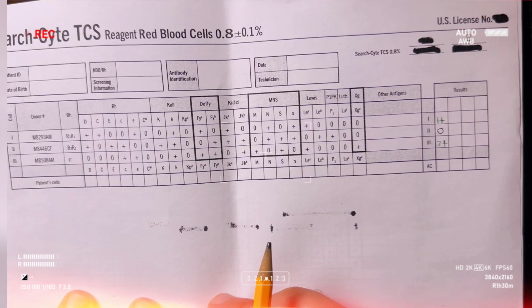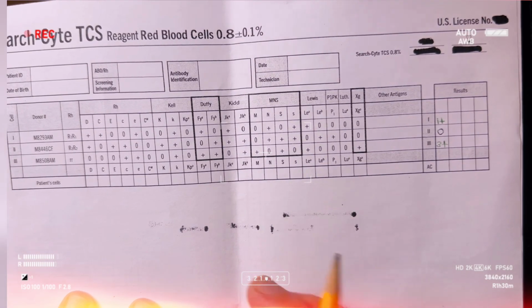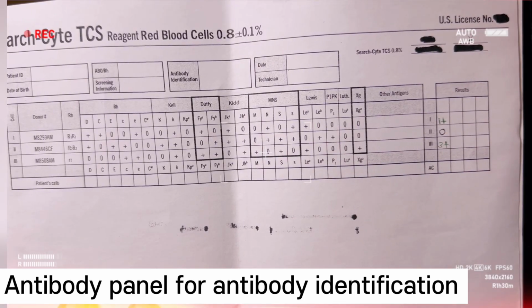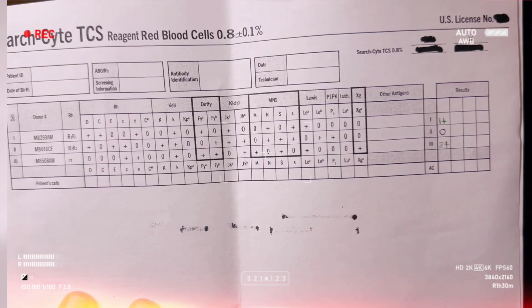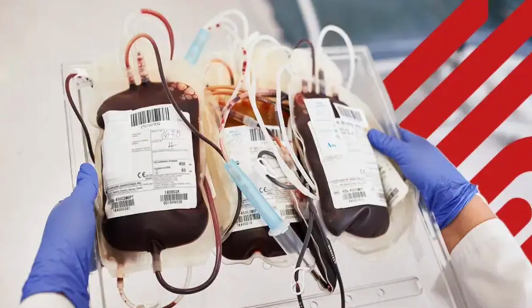Whether you are a medical laboratory science student preparing for the ASCP exam or HCPC exam, or working in transfusion medicine, this lesson will help you build your confidence to work on the antibody panel. We do antibody identification and the antibody panel to rule out clinically significant antibodies, so we can give the patient antigen-specific units for a safe transfusion.